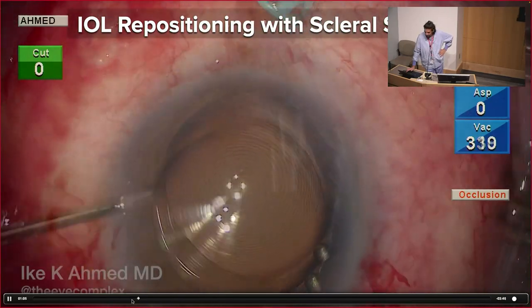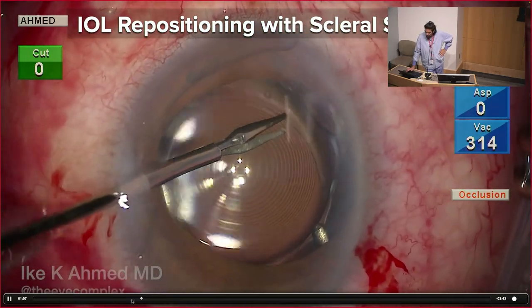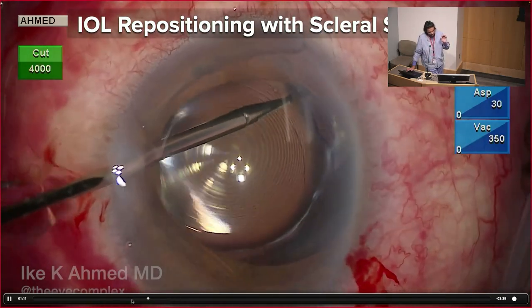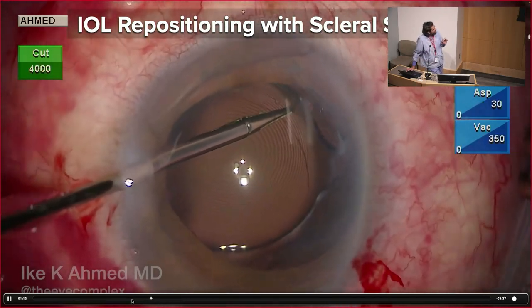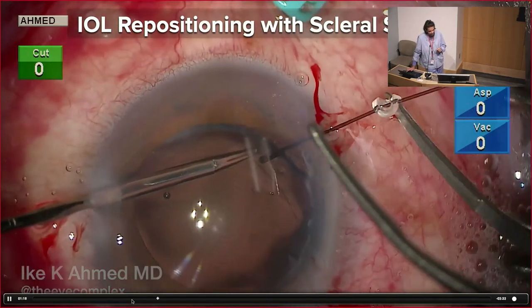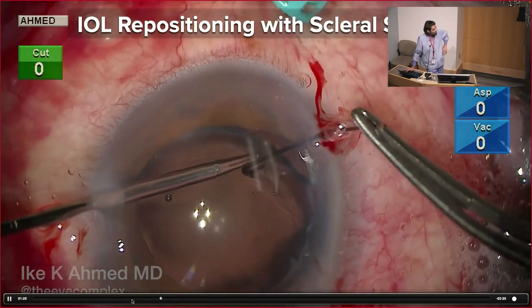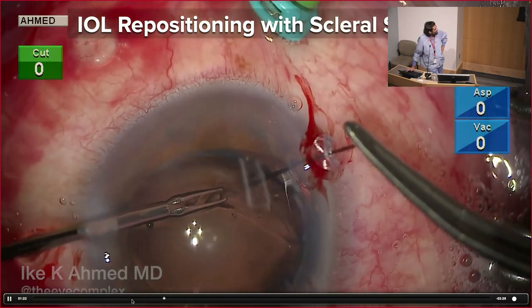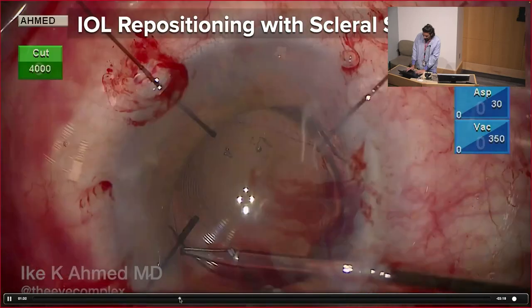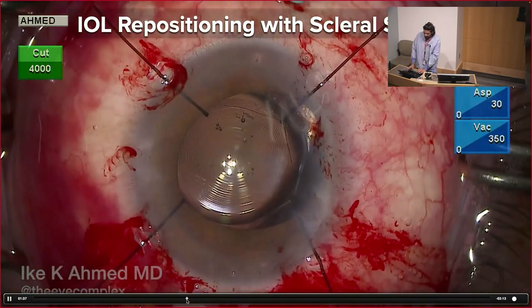And so the same approaches we use here. Again, using a micrograsper, we find it very helpful to grab the rexis edge. Your rexis edge is really your temporary stabilization point, whether it's a freshly dislocated crystalline lens, or whether it's a 7 years post-op case like this. And the iris hooks are really nice. They can really help support that bag well in 4 points. Now we have the IOL well positioned.